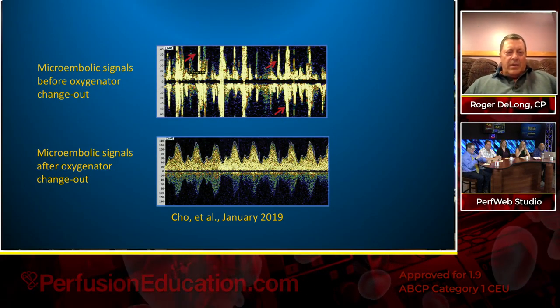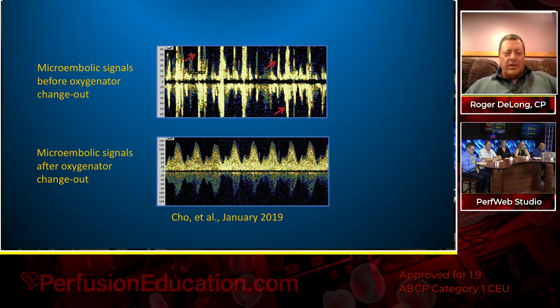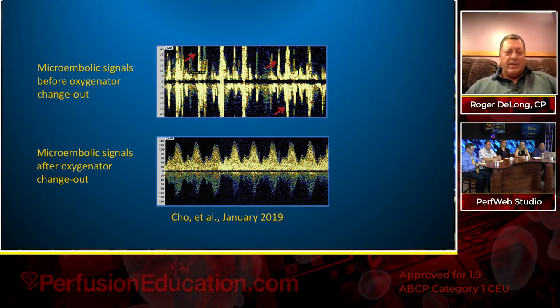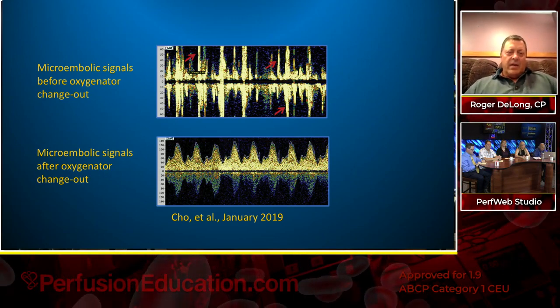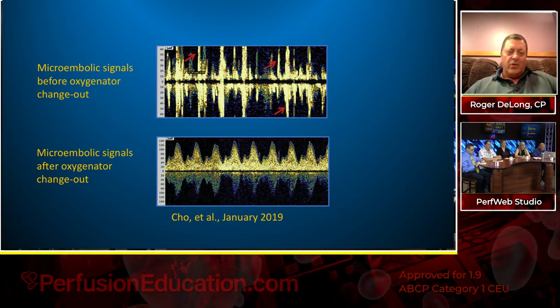And the upper screen is from the measurement he did the night that they were having trouble. The next day, they replaced the oxygenator, and that was the second test he got. So clearly, that's what you would expect. So anything outside of that, certainly not a welcome thing in your brain.